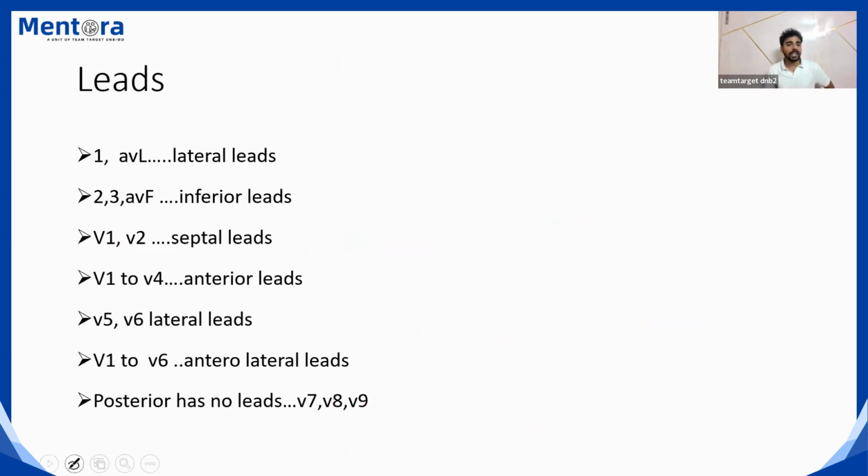And one more small basic thing: you have to know the leads. There are so many leads. There are different limb leads and chest leads. Chest leads are V1, V2, V3, V4, V5, V6. Limb leads are AVL, AVF, AVR. So many things to remember.